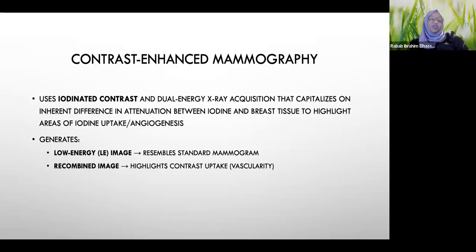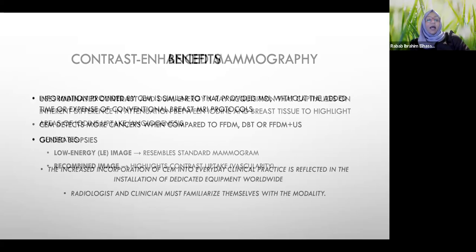So what is generated? Two images. A low energy image, which is similar to the standard mammogram, and the recombined image, which will highlight the areas of contrast uptake.